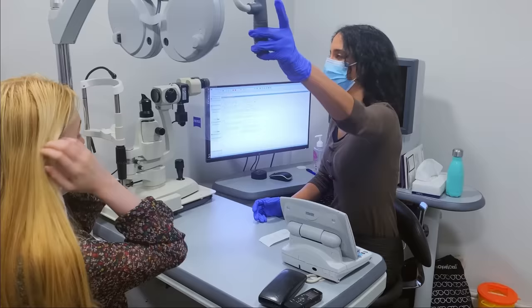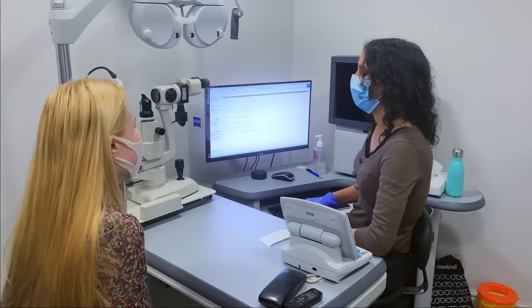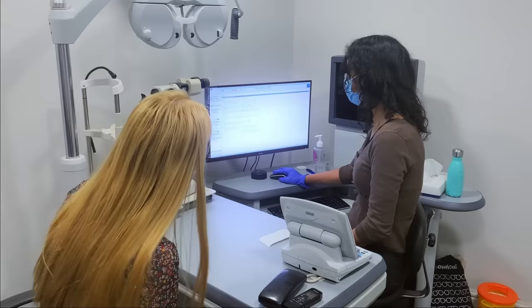Okay, good. So then, Melissa, in terms of your glasses prescription, actually it looks exactly the same, do you think? I'm sure you know you're short-sighted in both eyes, and you're minus one in both eyes. So, no astigmatism. How do you feel about your glasses? Yeah, that was good. It actually surprised me that I was able to read the small ones at the end. Very good. Not many people can. Excellent. Good, so you're happy with your glasses? Yes, yeah, I think so.